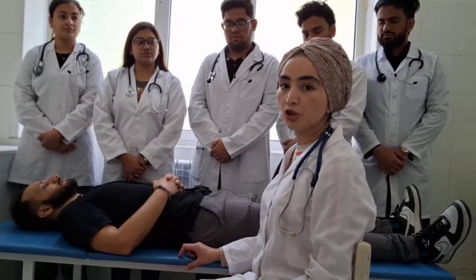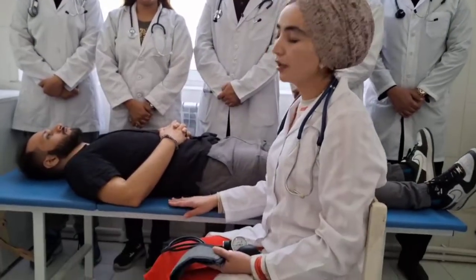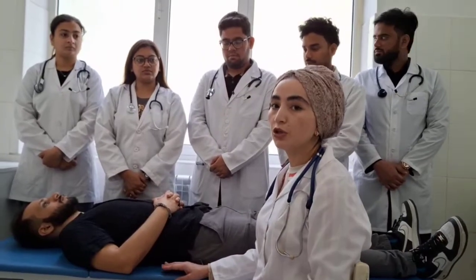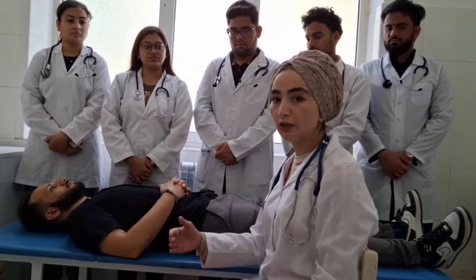On sitting position, we should remember that the back of the patient should lean to the back of the chair. In lying position, the patient is relaxed maximally. We should also remember that we shouldn't check blood pressure immediately after physical activities.